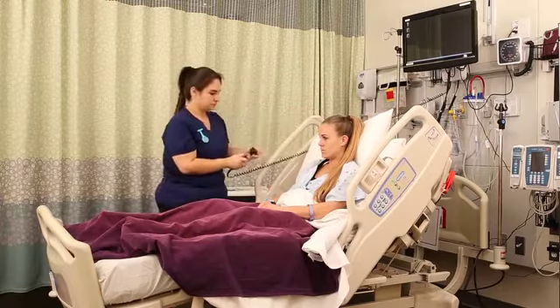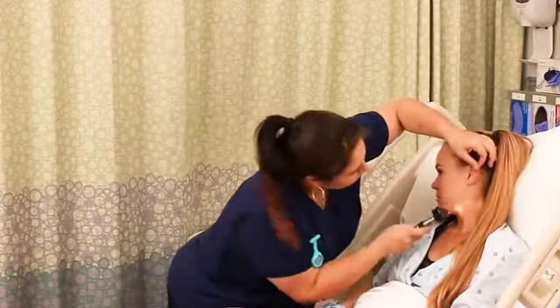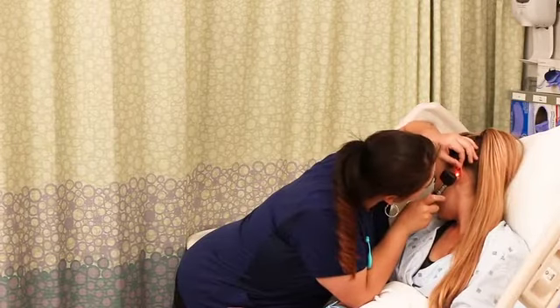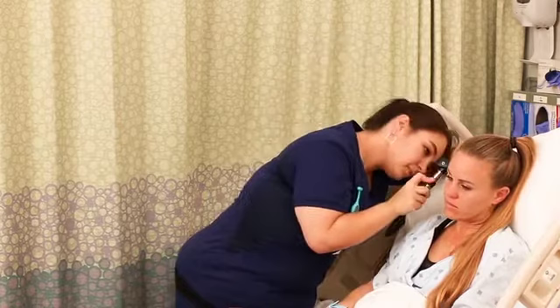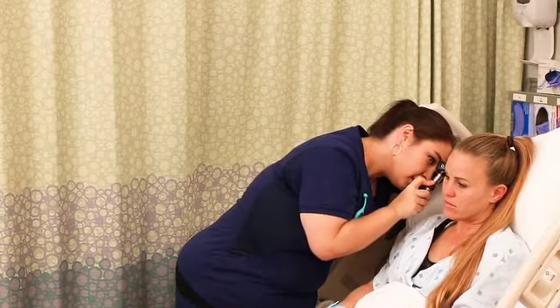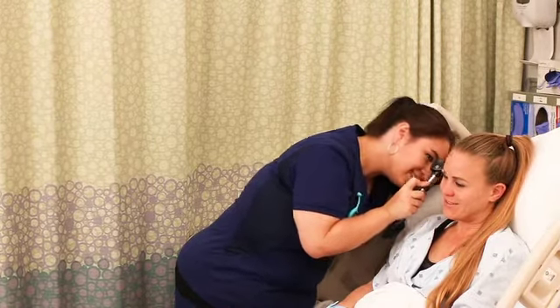Now, I want you to grab your otoscope and look inside the ears. For the adults, pull the pinna up and back. For kids, pull it back and down. Make sure your probe covers the right size and look inside the meatus. You're looking for any redness, swelling, discharge, maybe cerumen buildup. You also want to look at the eardrum. It should be pearly gray and translucent.